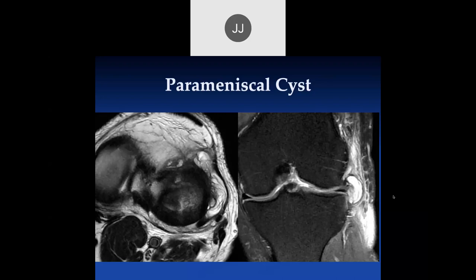But I've seen orthopedic surgeons and the radiologists miss the cyst, although the patient tells you the story that they feel a bulge there after they do their walking, and it disappears in the morning when they wake up. So when you get that kind of history, get them to do a little walking before getting an MRI.